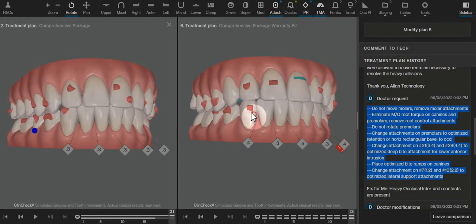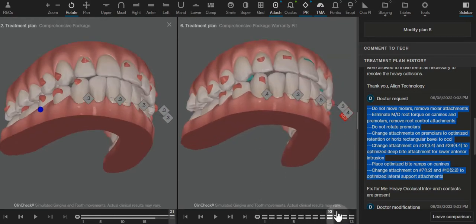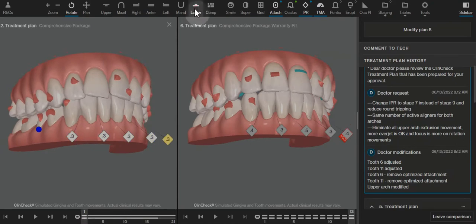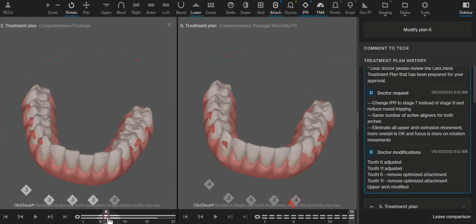I added bite ramps here because we always want to use those to not allow the molars to passively intrude throughout treatment. And I also asked to have the IPR done a little bit earlier because this is an example of round tripping, where the teeth are moving out, late IPR, and then pulling back in. So I looked at when we could possibly slip an IPR file through there at the earliest, and I guesstimated about aligner 7, anywhere between 7 through 10 would have been sufficient.